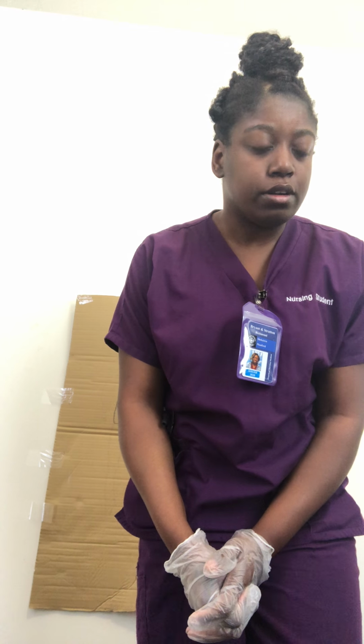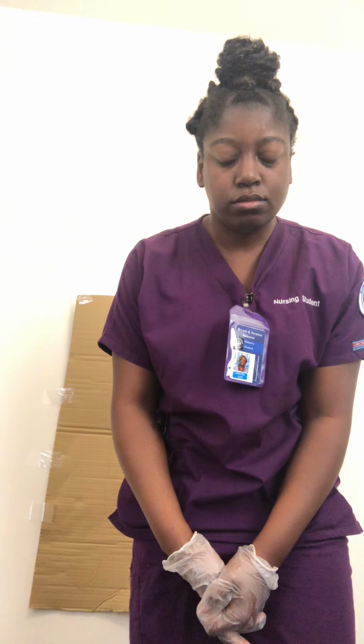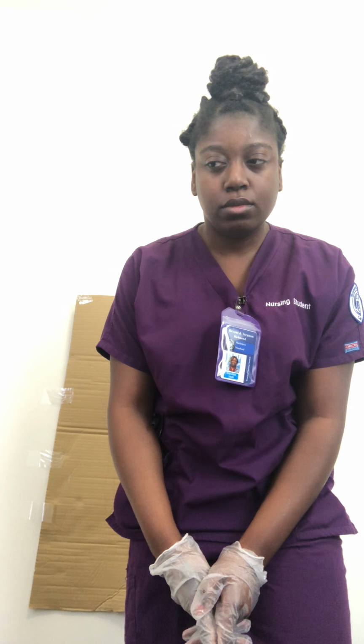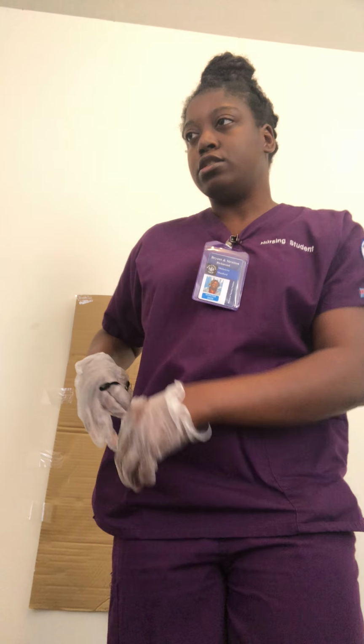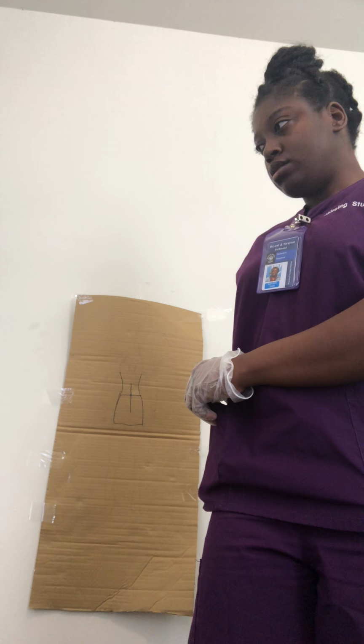I'm not sure when I auscultate using the bell of my stethoscope if I said no bruits noted at the end. If I didn't, I meant to say no bruits noted.